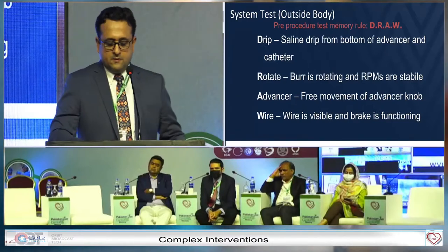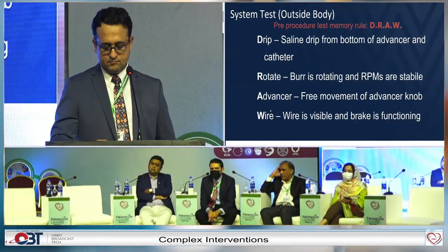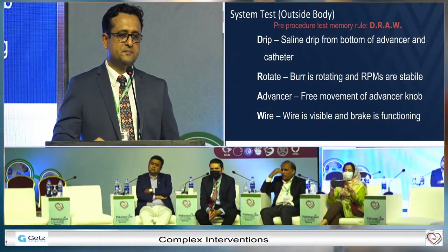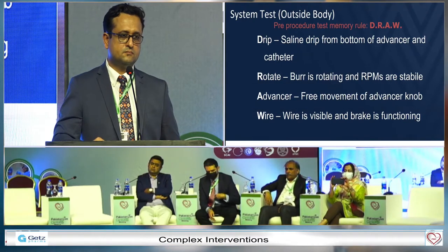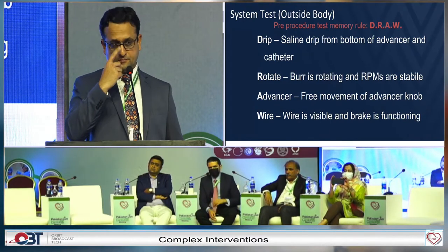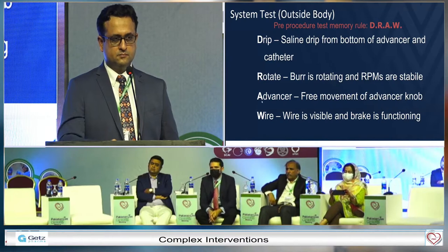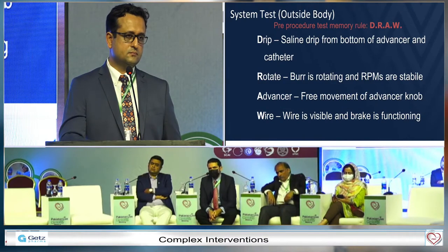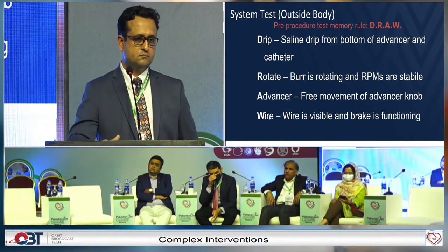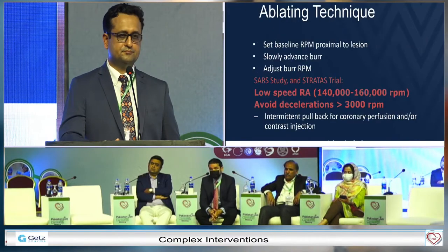When you advance the burr at the artery, first give a short run. If it jumps forward, that means you did not remove the slack in the system, so make it more neutral. It's okay to test in the left main to make sure that it jumps, and then position your burr just proximal to the lesion.